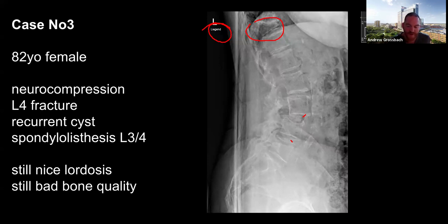This was an L3-4 fusion. I think lateral or TLIF would have been great for this at L3-4, but now with that L4 fracture, that takes that away. You've got to span across that. So you have to do a larger instrumentation now, probably using cement for the osteoporosis that is obviously still an issue with these ongoing fractures. So it becomes a bigger surgery, obviously. So it's a tough situation.